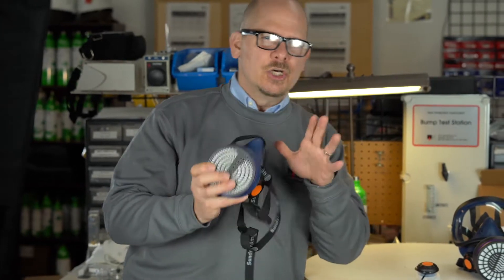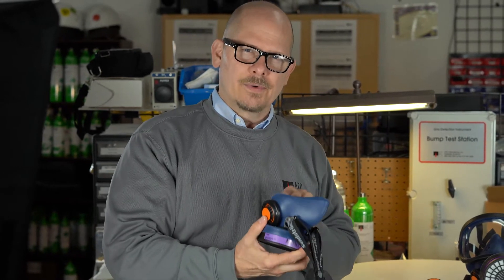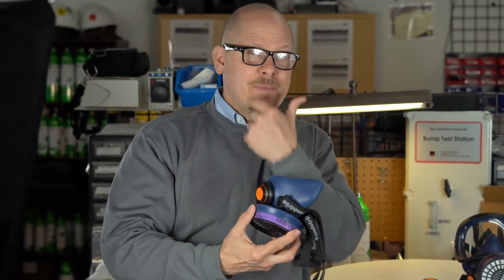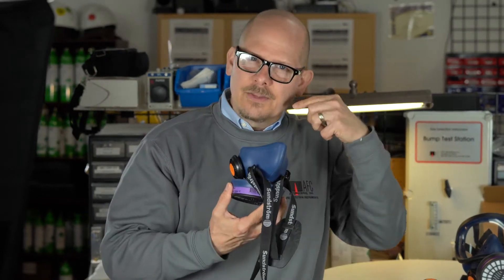When we get to fit testing, we want to make sure that the mask seal fits well. Even if we have dual exhalations and great inhalation, if I don't get a good mask seal around my face, what good is it? That's where it's going to leak through.